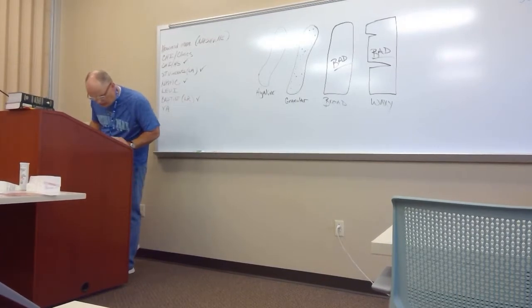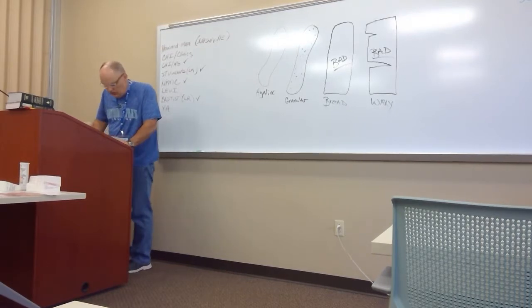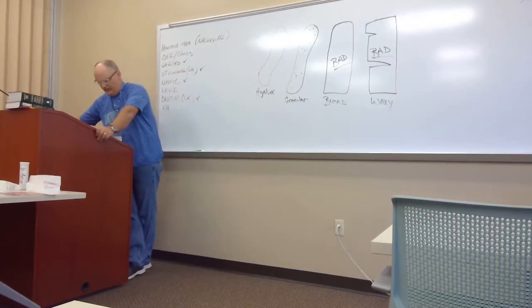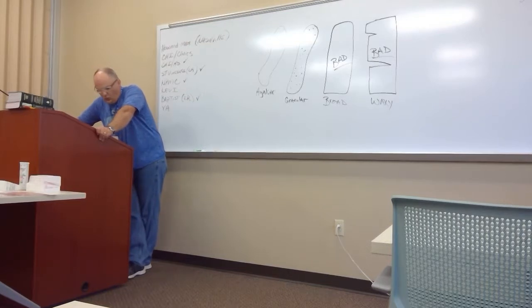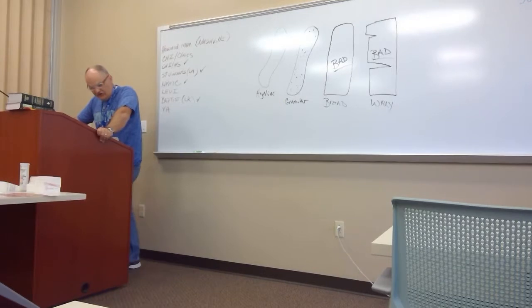Now, I will direct you to page 124, the right-hand column. Make sure you have this marked in your book, under white blood cell cast on page 124. In the right-hand column, the appearance of white blood cell casts in the urine signifies infection or inflammation within the nephron.